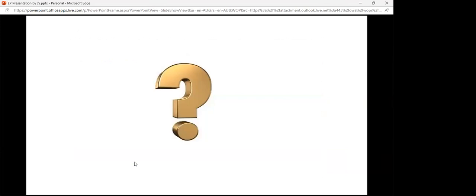Excellent. One question, Jarrad. Once that pathway is ablated, can it grow back again? Is it permanently gone, or can it come back again? No, they can come back very quickly, within seconds, within minutes, sometimes within days. Very rarely, well, what I've found anyways, I can't remember the last time I did a redo pathway ablation, meaning that once they're ablated, if they don't recover within the first 15 to 20 minutes, they're usually pretty good, in the sense that they usually will not recover.